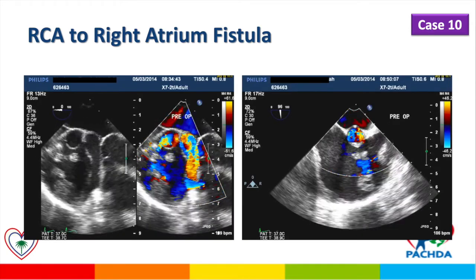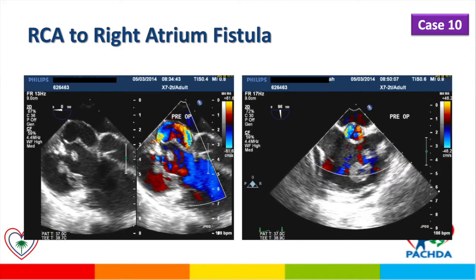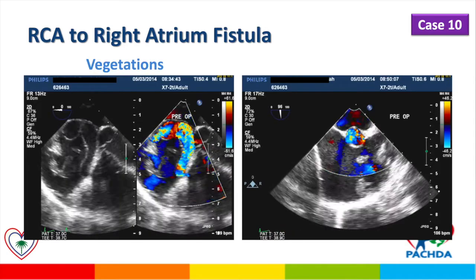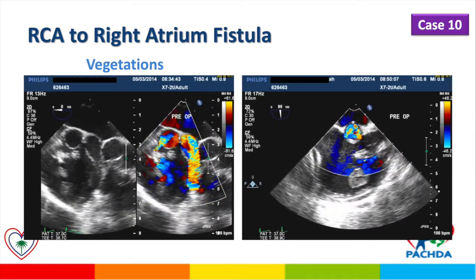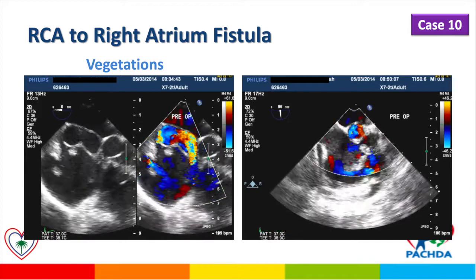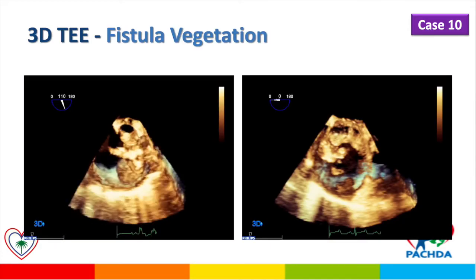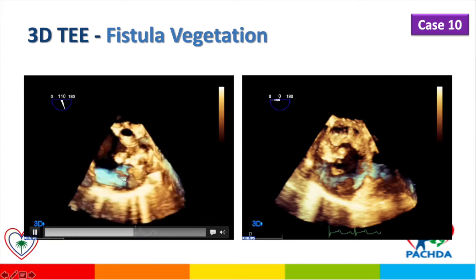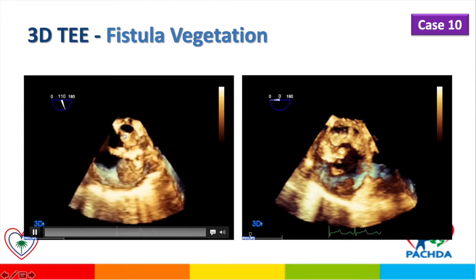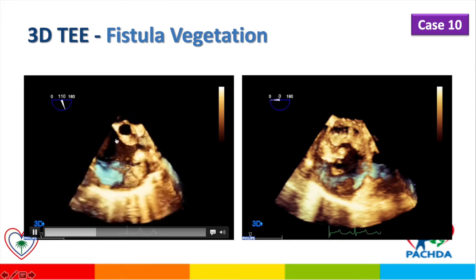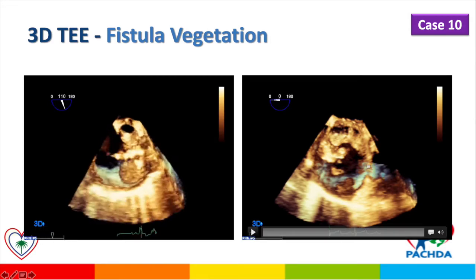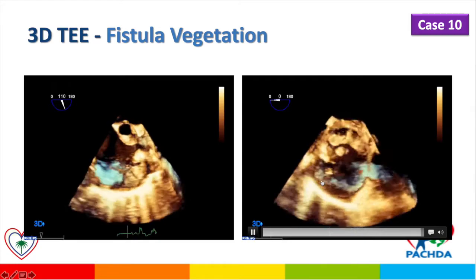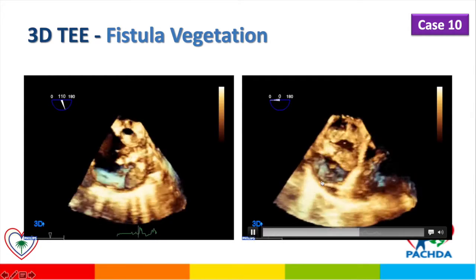At the exit of the fistula into the right atrium and right opposite to it, there are masses which are actually vegetations on the right atrium due to the fistula. So the fistula in this case was not a benign fistula — the patient had endocarditis and required surgical repair and removal of the vegetations. Three-dimensional echocardiography shows a large mass of vegetation, the fistula, and its mouth into the right atrium.